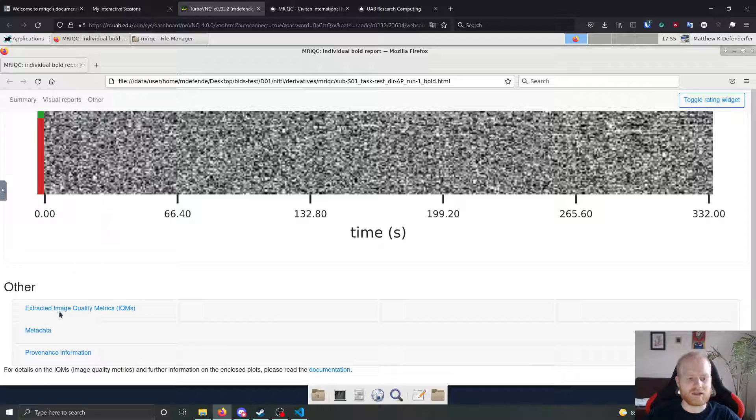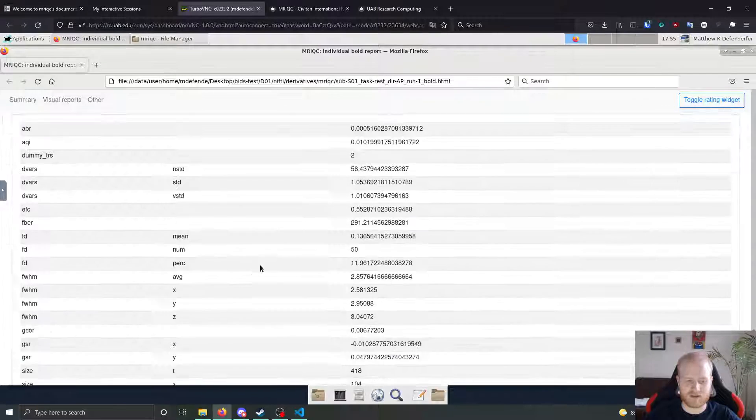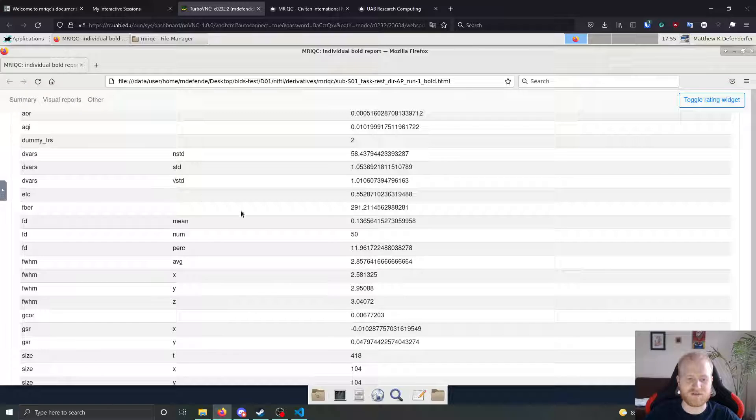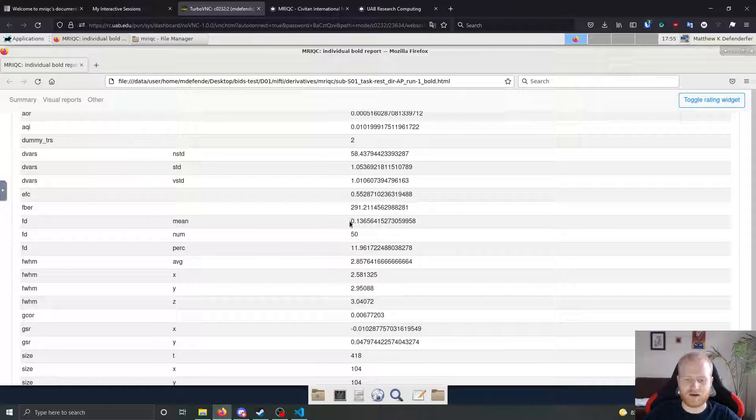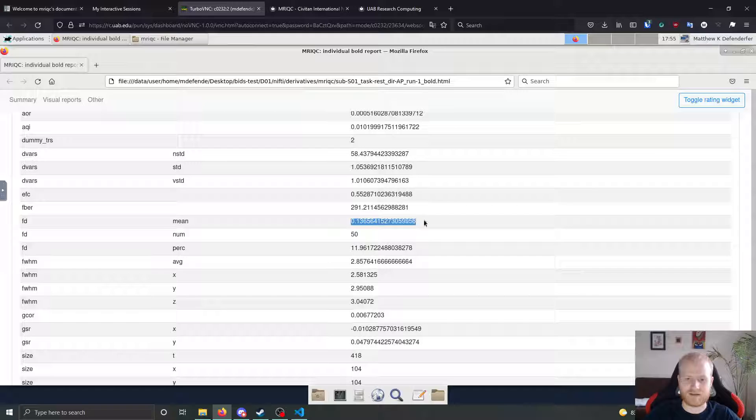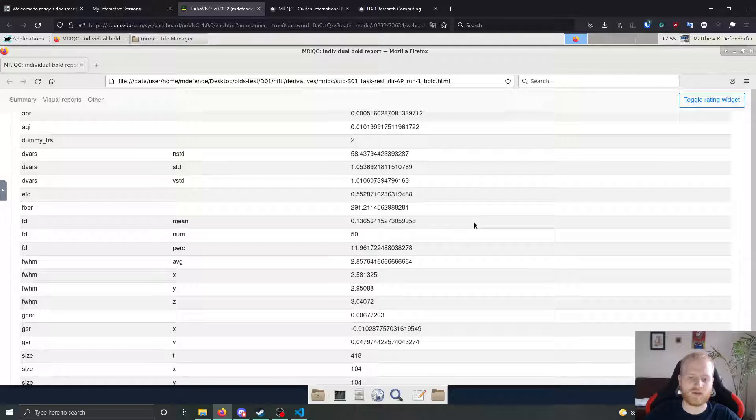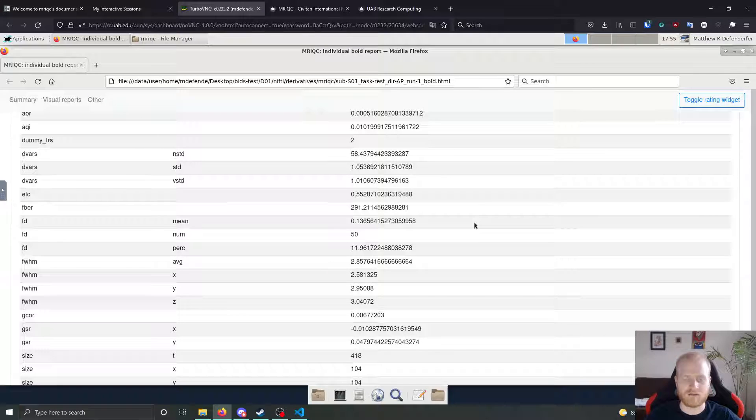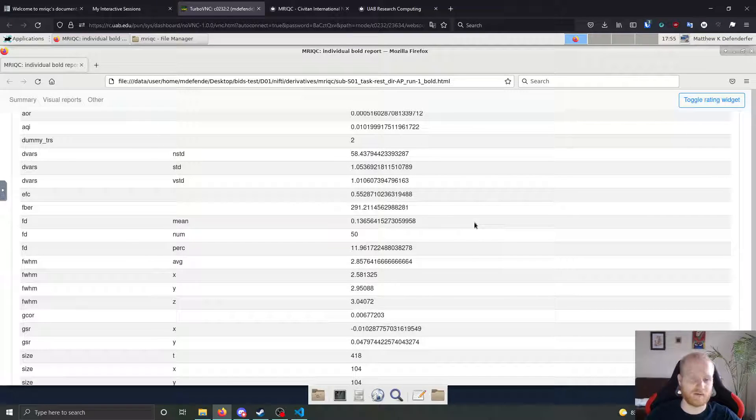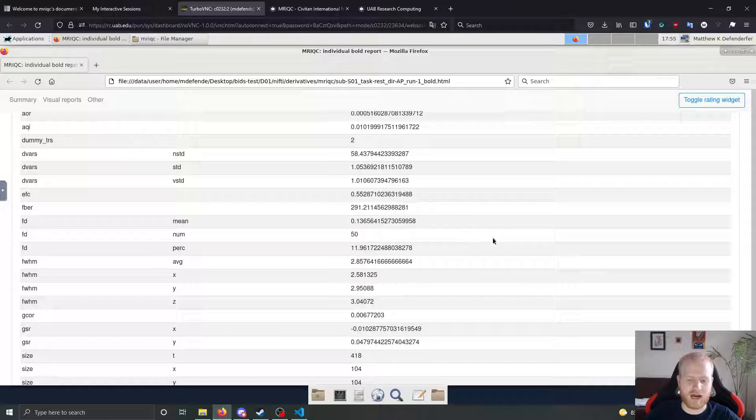Likewise, to the structural image, there are image quality metrics that are extracted from functional images as well. So things like mean framewise displacement in our case, this scan had a mean framewise displacement across all of its volumes of 0.137. So that's pretty good. Like I would say that's a pretty high quality bold scan.